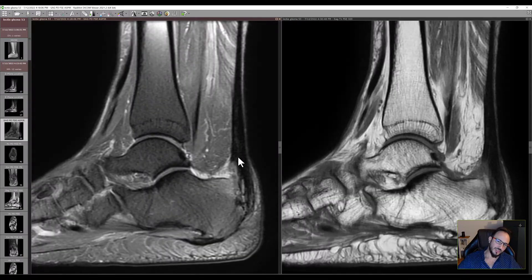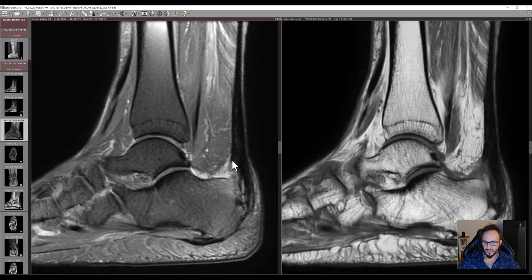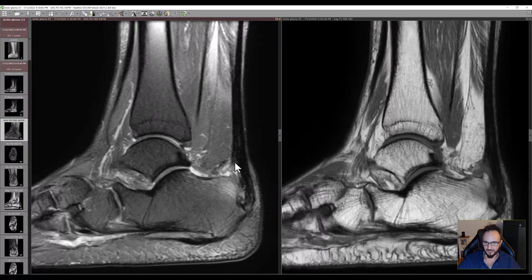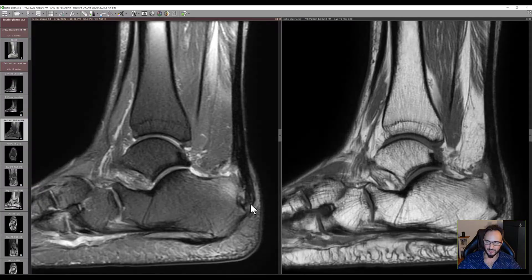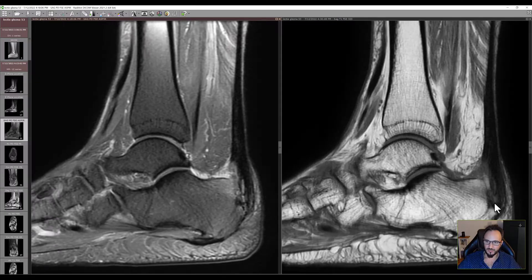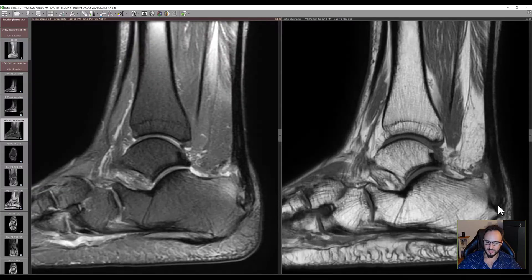This is a huge enlargement of the Achilles tendon, which is quite torn here. So this is hugely tendinopathic, especially in this area of insertion. This area of insertion is also quite irregular, and there is a lot of inflammation in the bursa — the retrocalcaneal bursa.